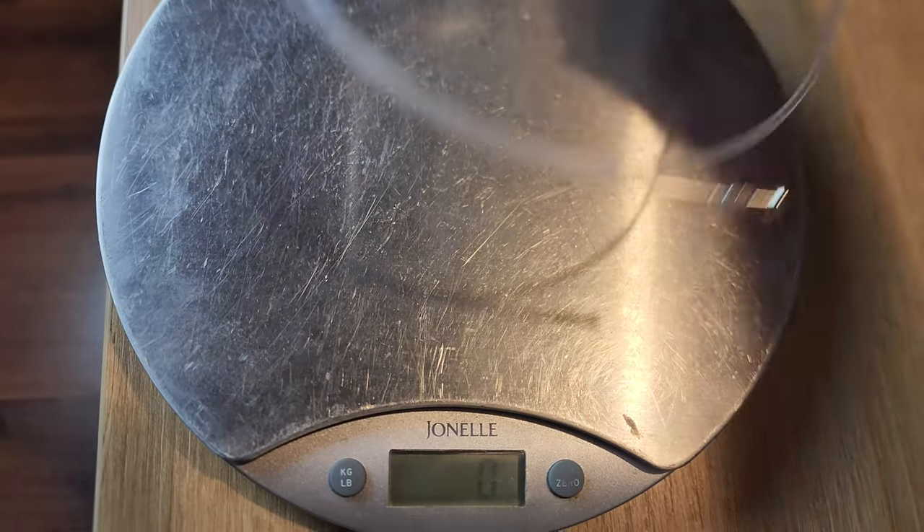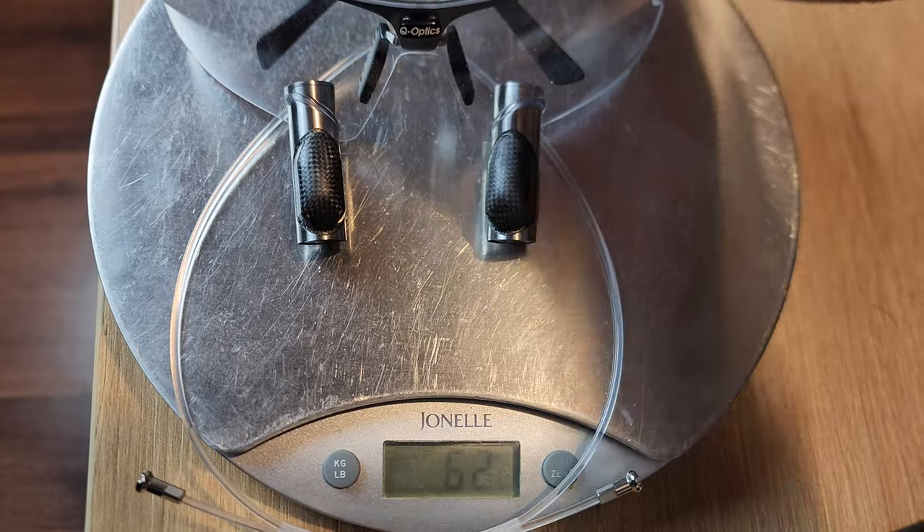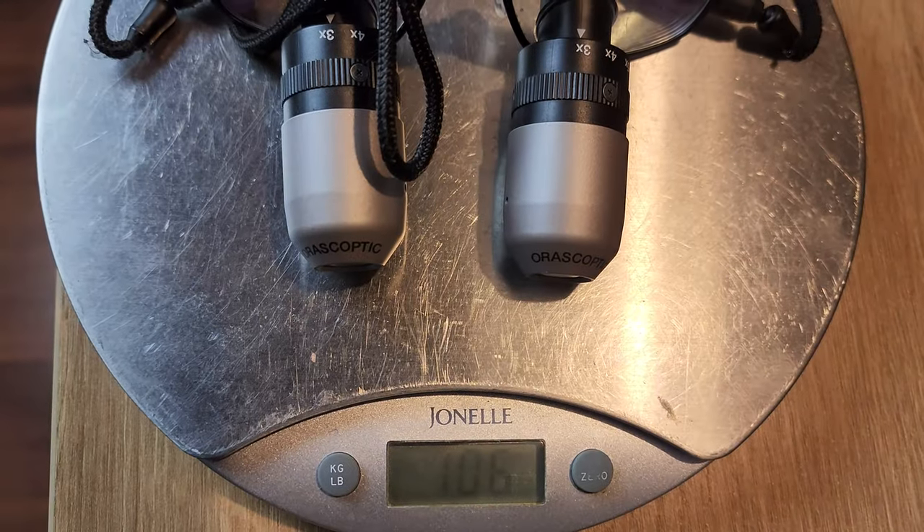I'll include footage of them on the weighing scales, but to demonstrate here: putting the Eye Zooms and the Q Optics on my pinky finger — I can feel the Eye Zooms are heavier. Moving them side to side, the Q Optics move very quickly because of how light they are; there's no inertia. The Eye Zooms don't move as quickly because of their weight. Hopefully that's a useful visualization of how light the Q Optics are.